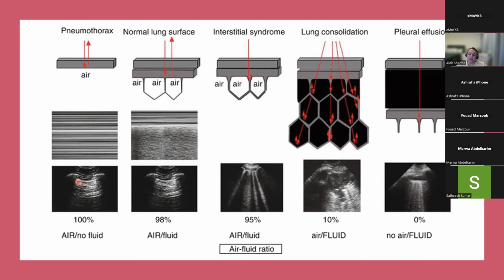So really what you've got over here is normal lung. So we're focusing on here. Forget the pneumothorax, forget everything else. So when you look at the normal lung, sound waves are incident. They will naturally get reflected back. You'll have acoustic shadow behind the ribs, but they'll interact with the pleura, which is bright. And because there's aeration of the alveoli, there's air coming in and out, alveoli collapsing and moving, that will cause the visceral and parietal pleura, if you look at my hands, to move over each other, and that produces lung sliding. But more importantly, because they interact with the pleural margin, they will create horizontal reverberation artifact, which will move down.